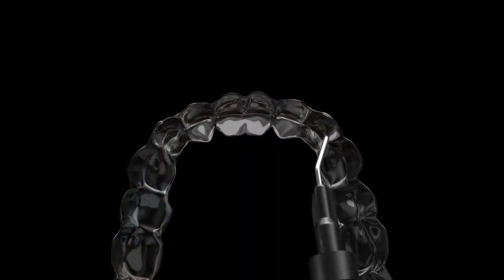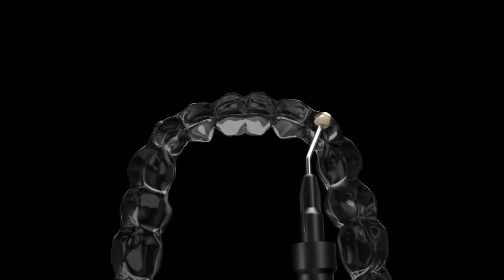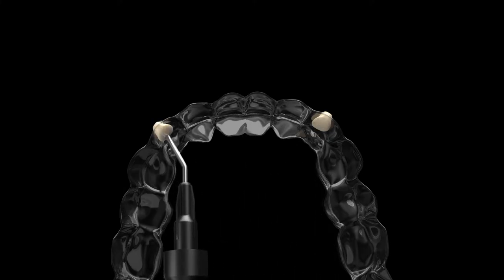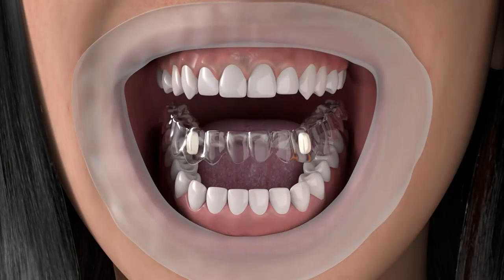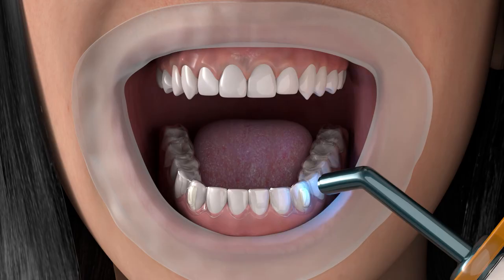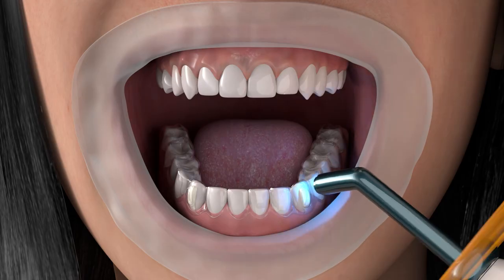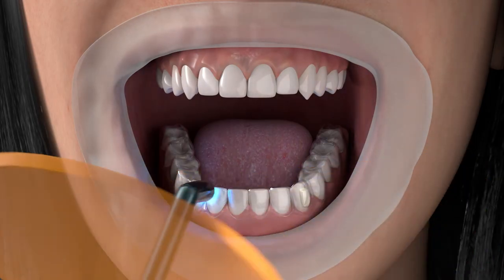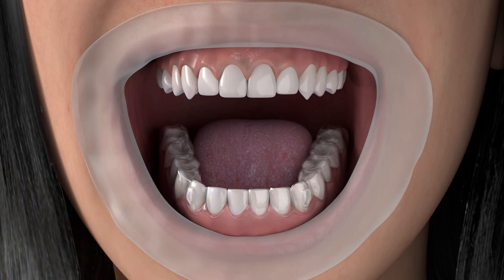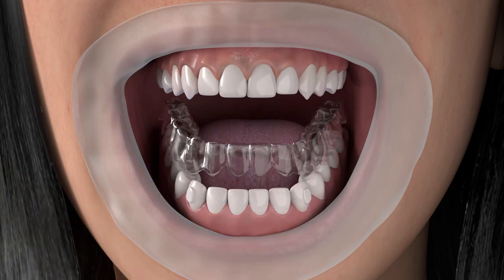Load the button wells with composite material. Place the aligner tray into the mouth. Light cure the composite material through the tray. Follow the manufacturer's instructions when curing the composite for the buttons. Remove the aligner tray from the mouth.